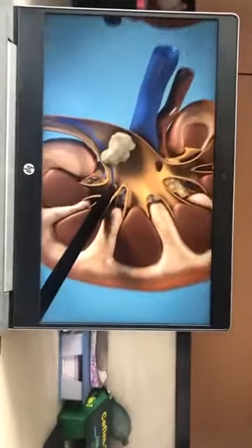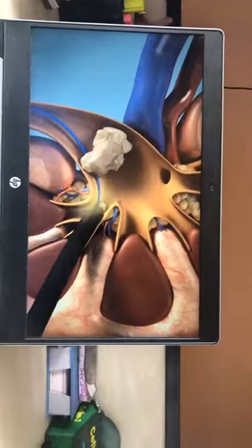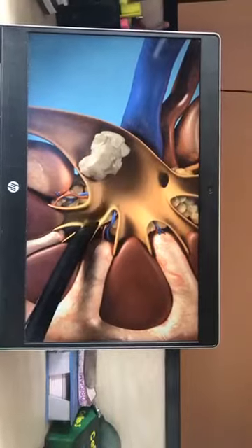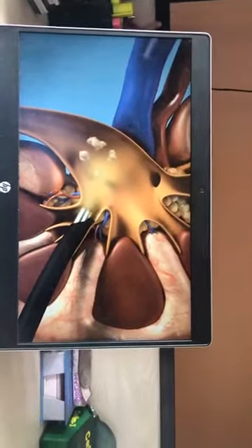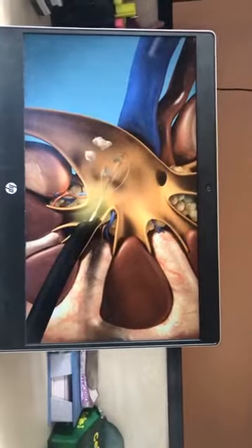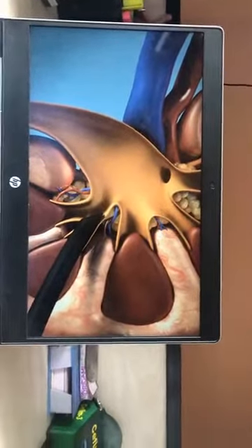Through the sheath, introduce the nephroscope. Through the nephroscope, the small stone can be picked up and removed. Larger stones are broken down by either laser lithotripsy or pneumatic lithotripsy, whatever is available. You can break the stone piecemeal and remove it through the nephroscope.